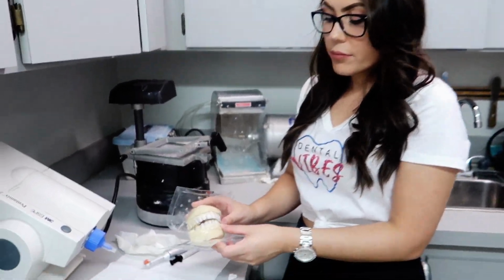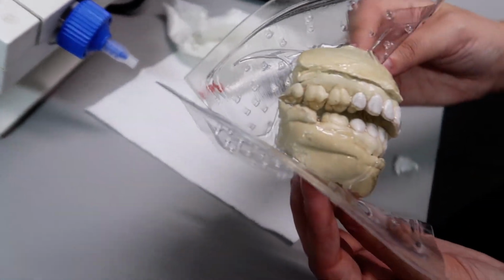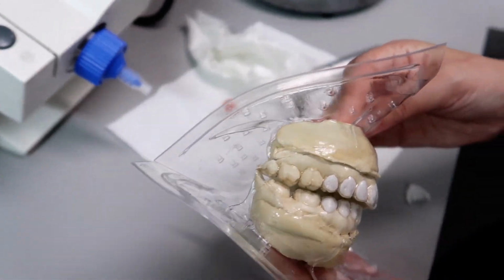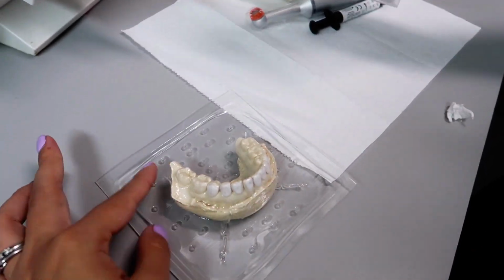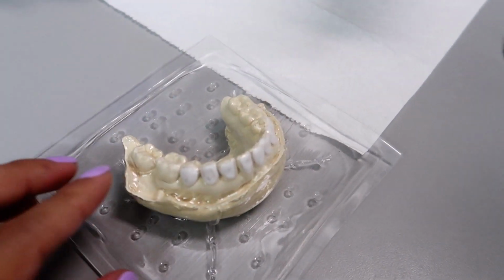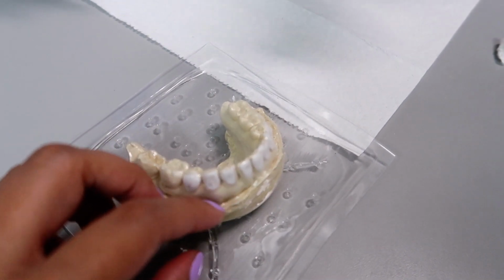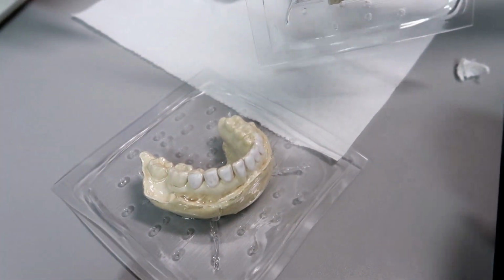I do think if we can get a close-up of the lower one, maybe sometimes in the buckle areas. I'm touching your bleaching trays without my gloves. It's okay, Carla. This is what we're talking about. That's where the material goes. But with your trick of touching it and kind of molding it, it helps.